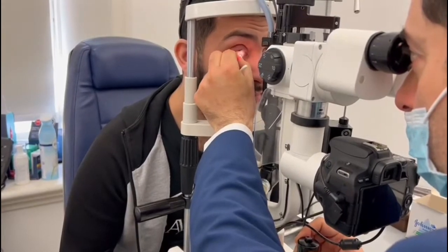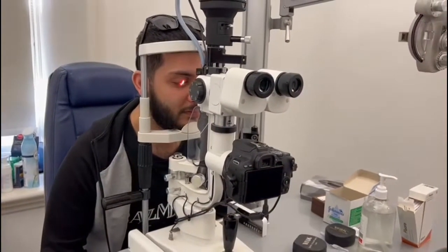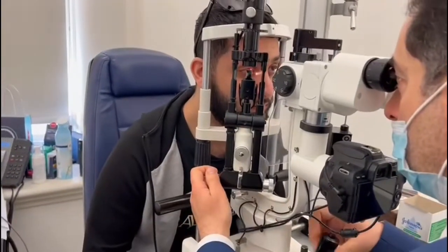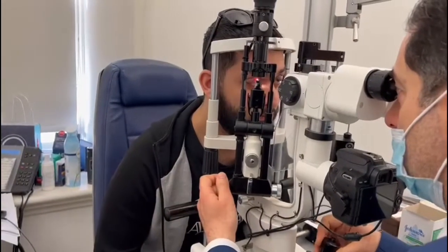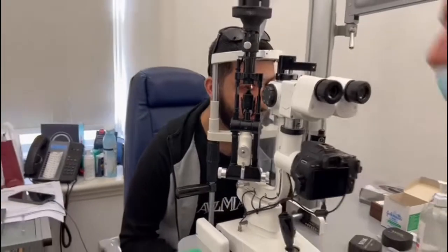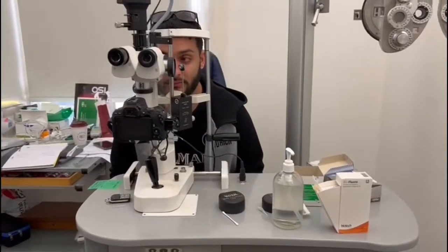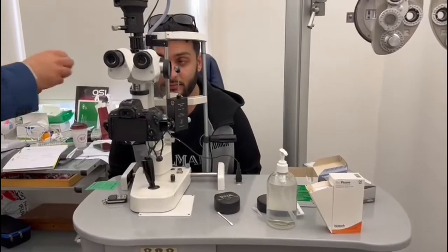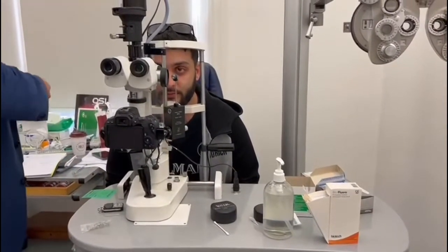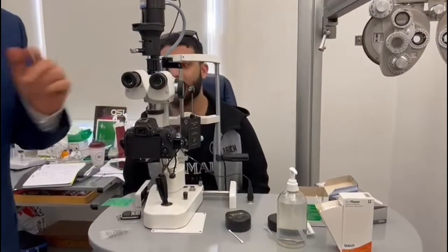Look up for me now. So let's get it out. I'm going to put some drops now, if that's okay. So what we need to establish now is that the epithelium — the skin — when it moves, it has healed back; that's what we're trying to do here. I'm just going to get some tissue, press back for a second, I'll come back myself.